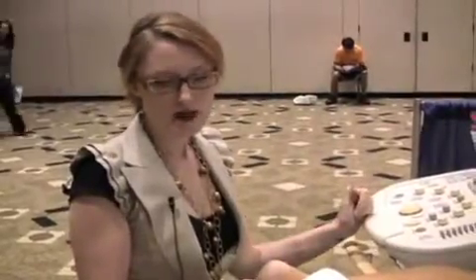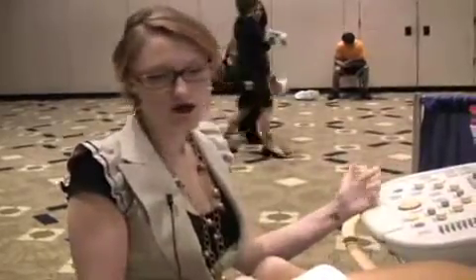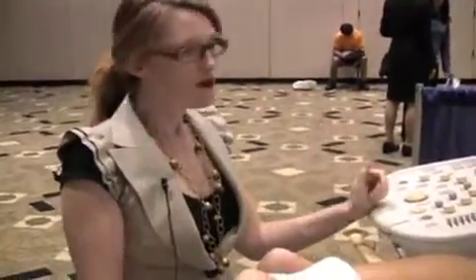I'm just going to cover the major structures and the major things that can potentially go wrong in the foot and ankle. But again, like in all areas of ultrasound, you need to expand your study according to patient symptoms. So that's really important to be aware of. So we'll start with the plantar aspect.